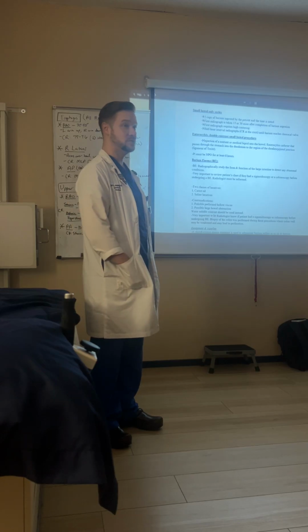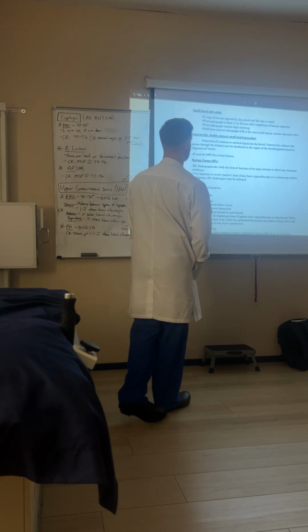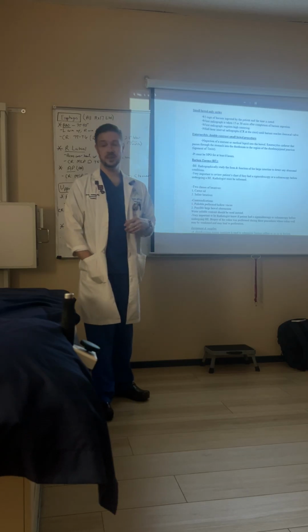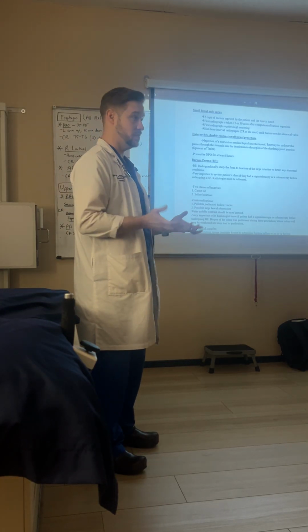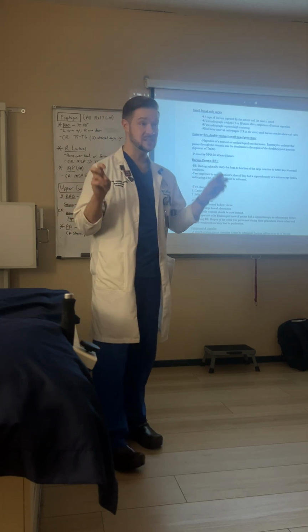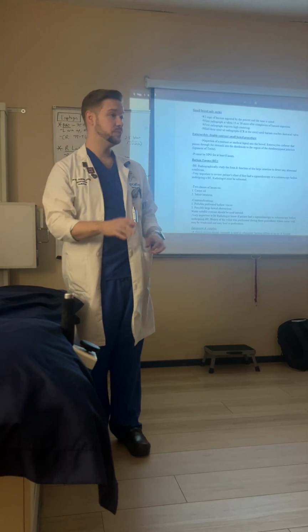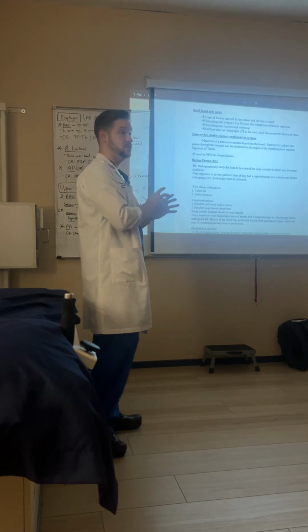What abdominal radiographs are centered at the crest? Yes, KUBs, until the barium reaches the ileocecal valve. Okay? Most of the time, well, sometimes, if you're in an adult hospital, the radiologist will want to know when the contrast has reached the terminal ileum so they can come in and do what's called spotting the TI. They will take that compression paddle and apply pressure to the patient's abdomen and separate the bowel loop so they can see that point where the ileum reaches or is connected to the cecum.